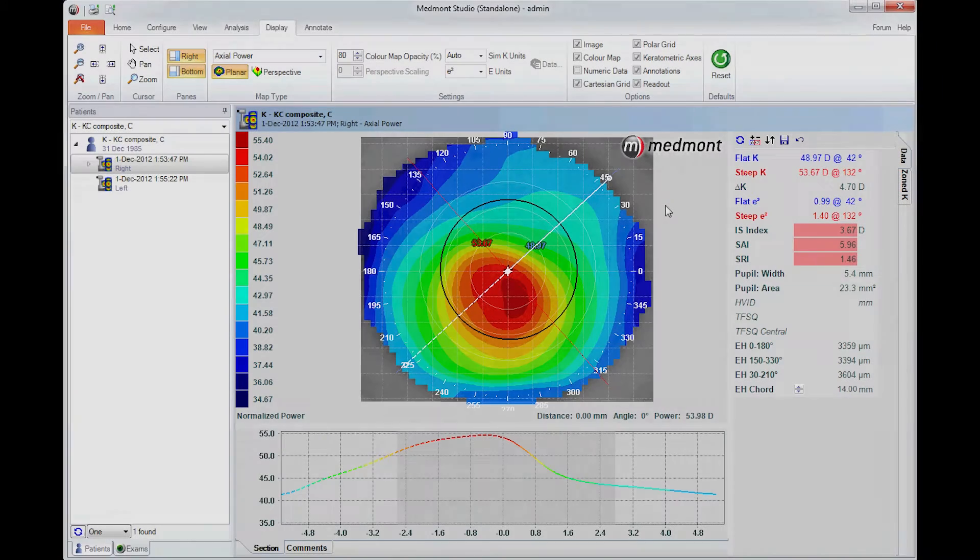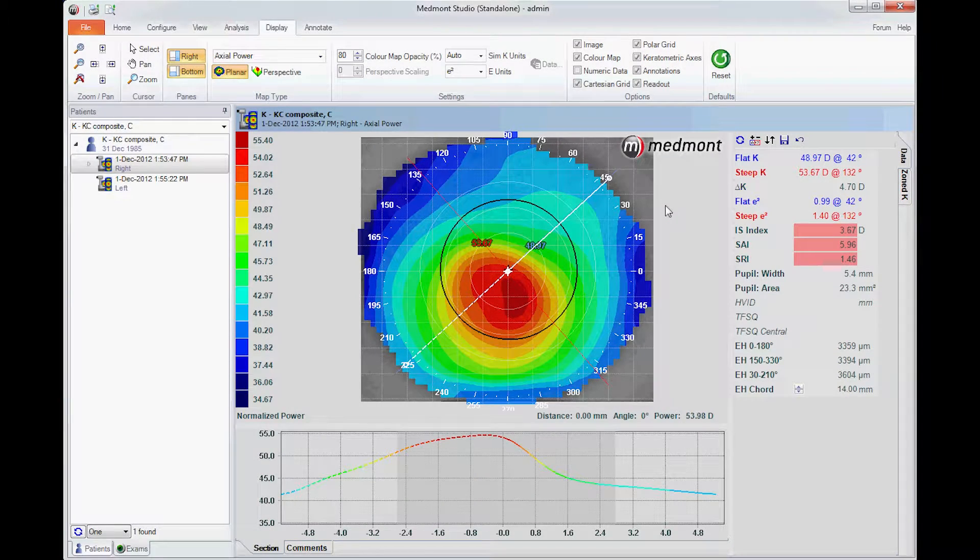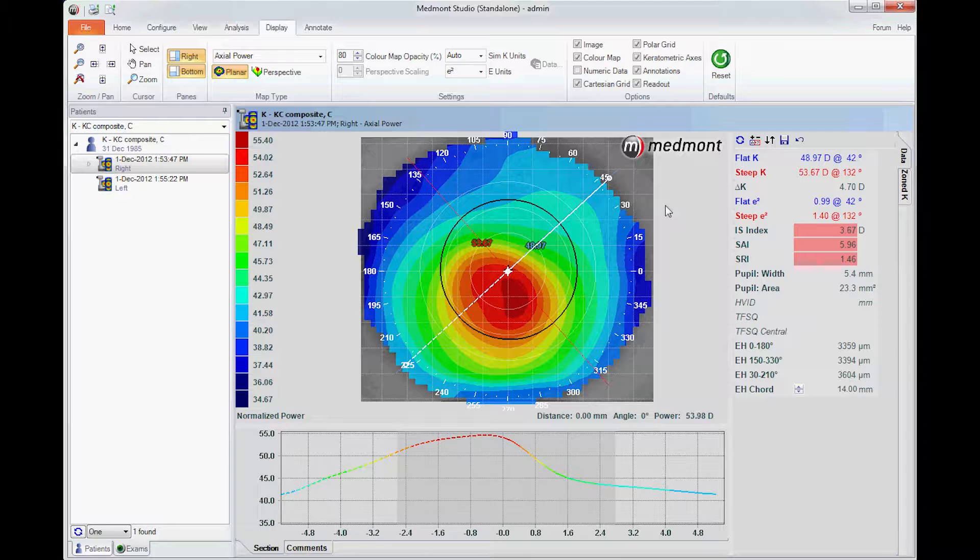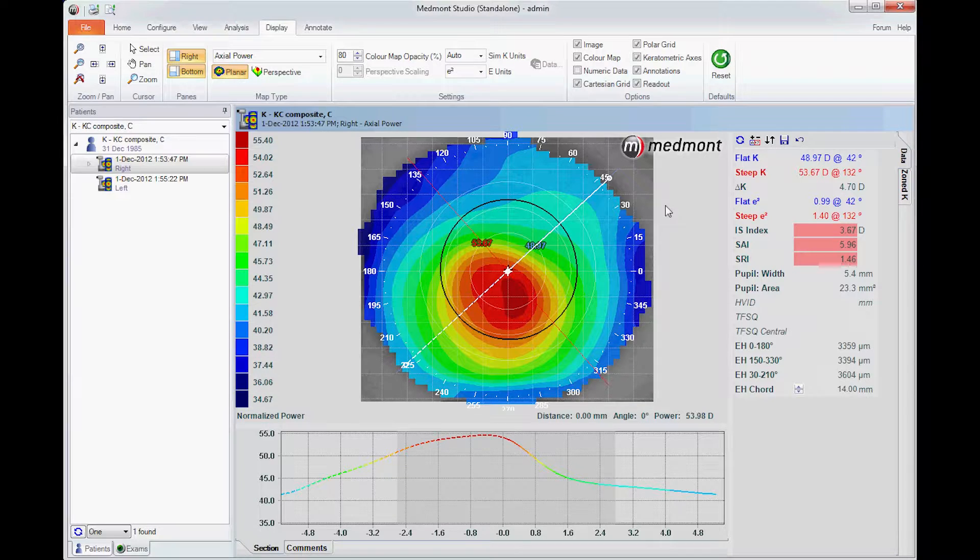One of the new features available in the Medmont E300 Corneal Topographer is an attribute that helps us to determine the sagittal height of lens that we might require when fitting beyond the cornea. An example might be a custom soft lens or a scleral contact lens.